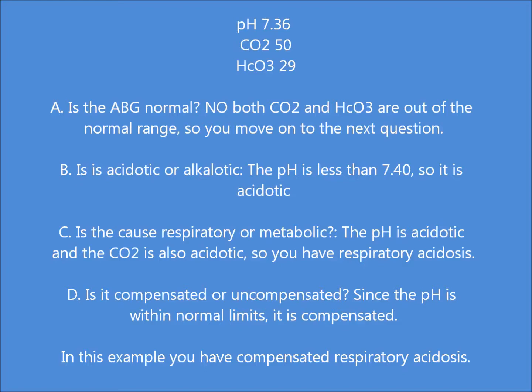Is it compensated or uncompensated? Since the pH is within normal limits, it is compensated. In this example, we have a compensated respiratory acidosis.